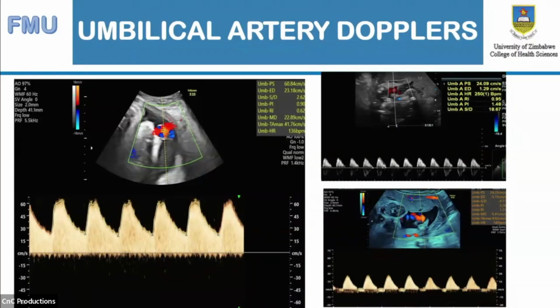And it actually confused the obstetrician, who was also already confused, because it didn't mean anything to just give numbers. Just like what Dr. Shiruma was doing, giving us those predictive values. I was just saying 0.2 times 5.0, what does it mean? So for the umbilical artery, the most important figure actually is the pulsatility index.